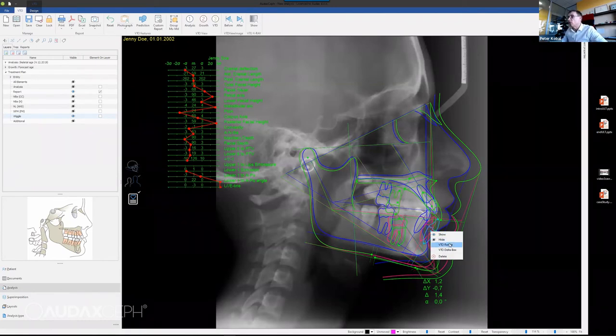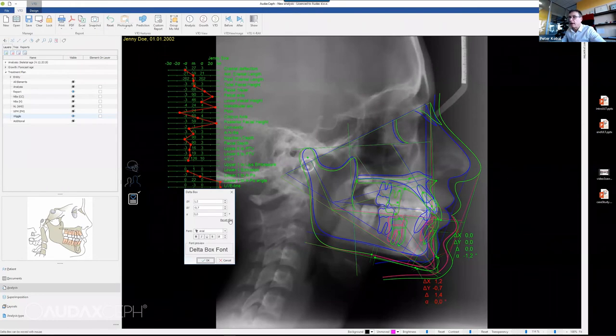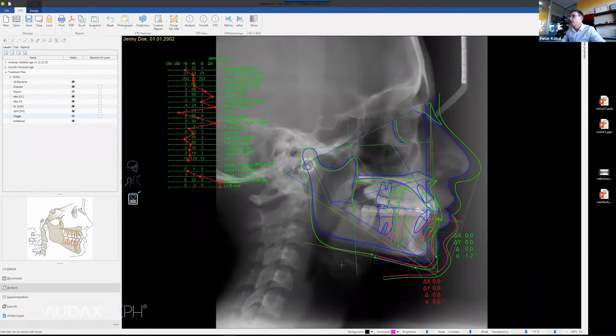You can do also the rotation. So you can do something like this, and so on. One thing which is important is that I can double click, I can reset that back. So if I make a mistake or something, I can reset that situation back.